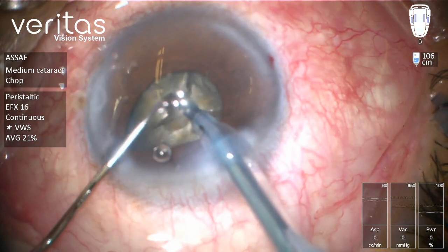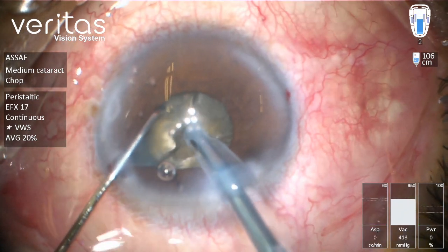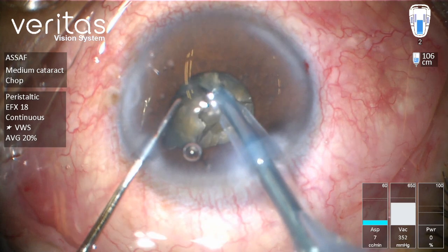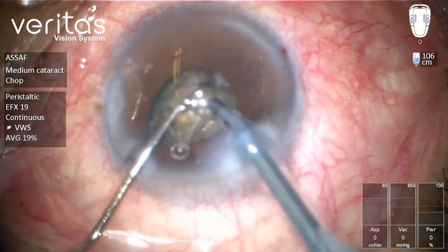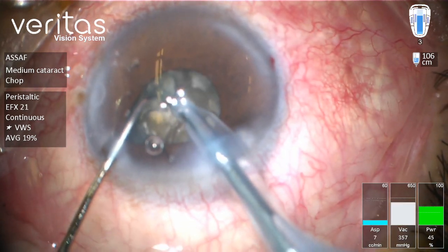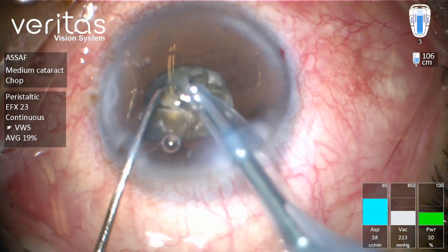Here we have four not completely separated quadrants. In an attempt to reduce ultrasound power, I'm trying to conquer each quadrant. I don't insist on complete separation of the posterior isthmus because it might jeopardize the posterior capsule in this case.